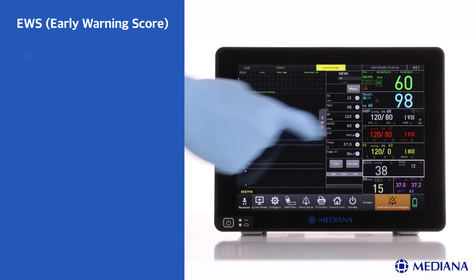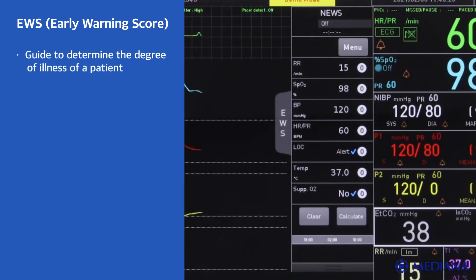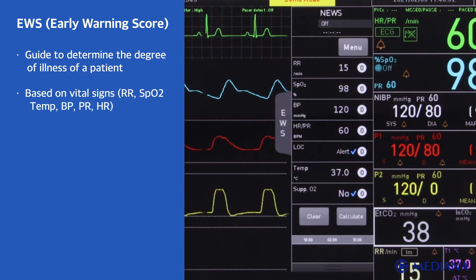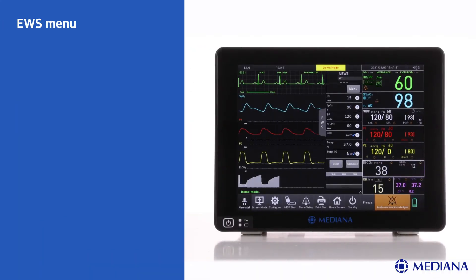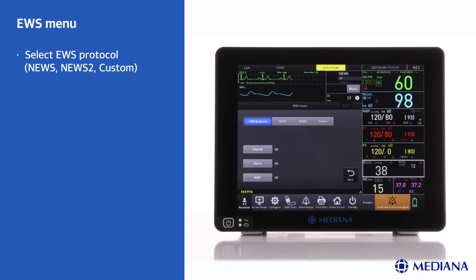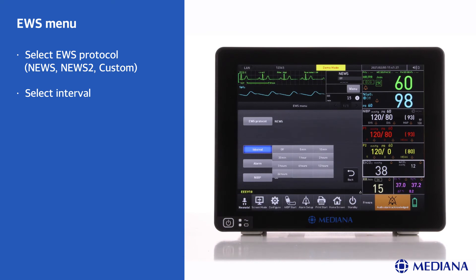Based on several vital signs, the early warning score helps to recognise the early signs of deterioration in patients and triggers an appropriate alarm. The monitor also displays the early warning score menu when pressing the menu button in the early warning score area. In the menu, the protocols can be set. By pressing the confirm button, you can save the trend data including the early warning score total value.